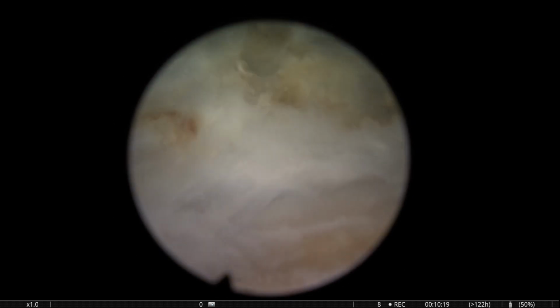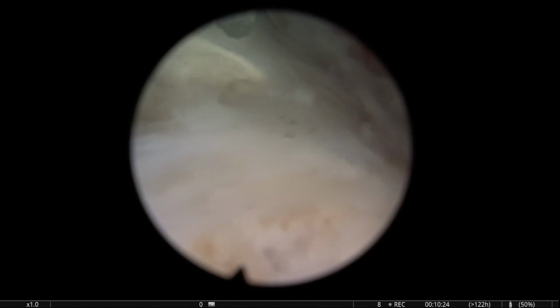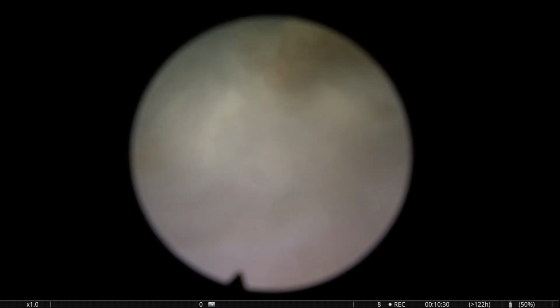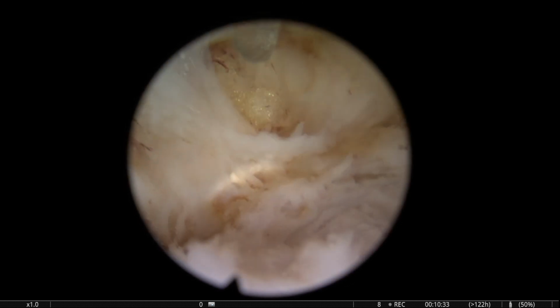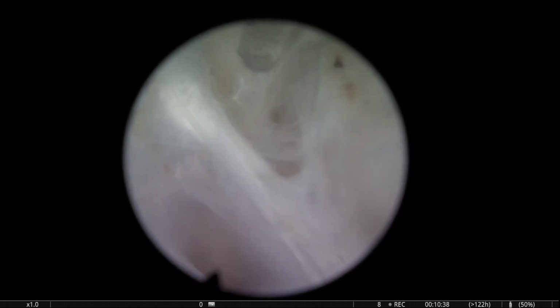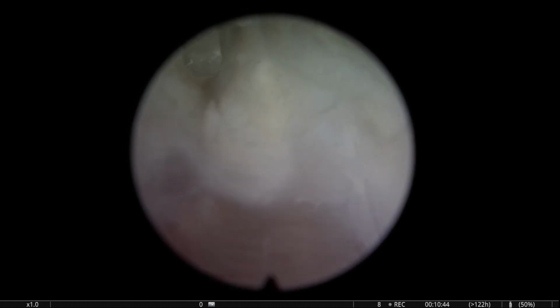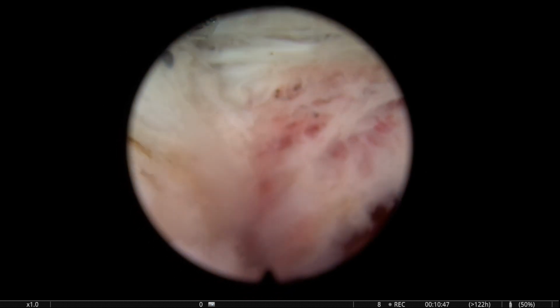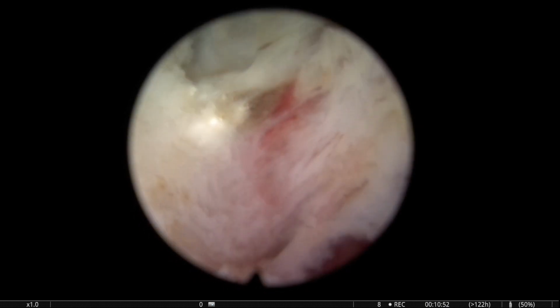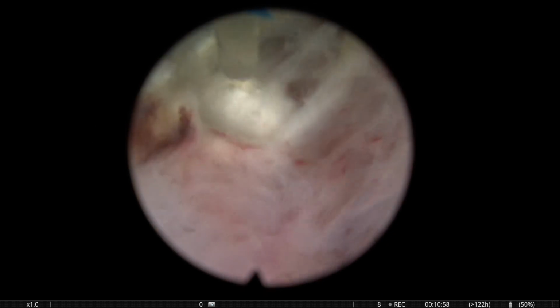Here you can see clearly how the plane is correcting itself. There we are. You see that's a little bit of fat visible, probably millimetric small perforation. So we're going to continue always trying to move slowly, always trying to develop a proper line. Here again, you see the plane that we are taking from above coming down is deeper than the one we had. So we try to connect the lines, try to understand better.